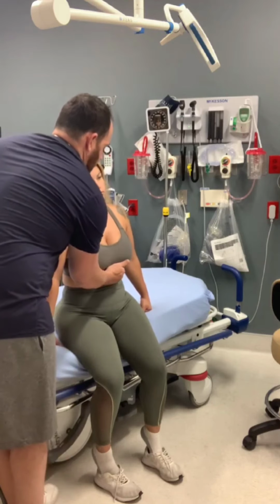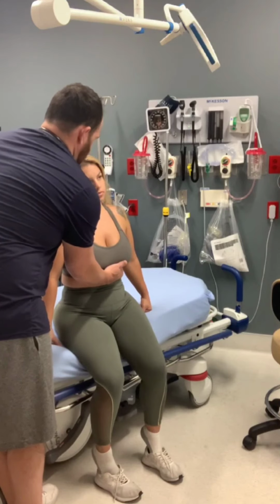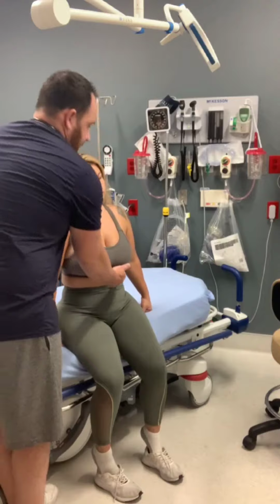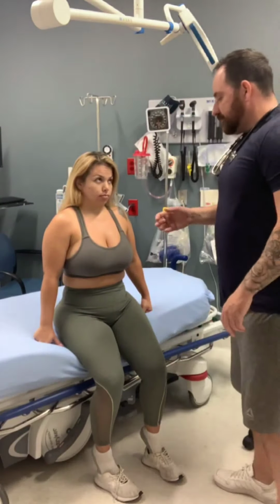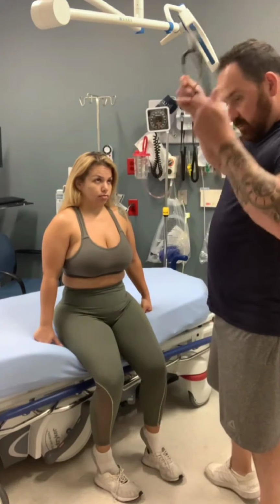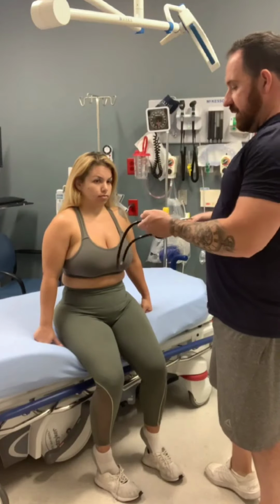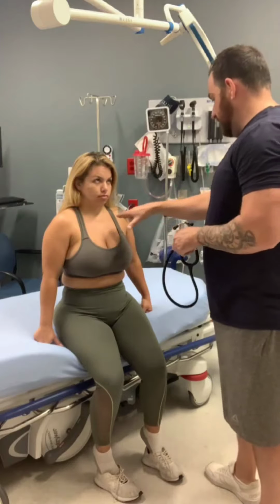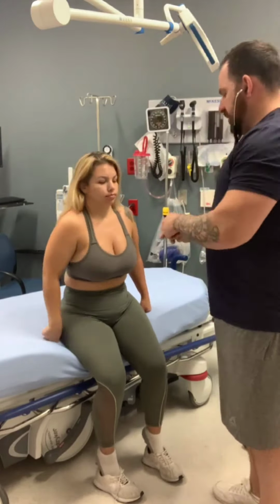And again, I'm going to feel for your PMI. I'm also going to do it while you're laying down because it's a lot easier when you're laying on your left side. All right, so I feel no heaves, no lifts. And from here, I'm going to auscultate with the bell and the diaphragm of the stethoscope in those same 5 areas, okay? I'm going to get you to sit up. You can lean slightly forward. Just makes it a little bit easier to hear the sounds.